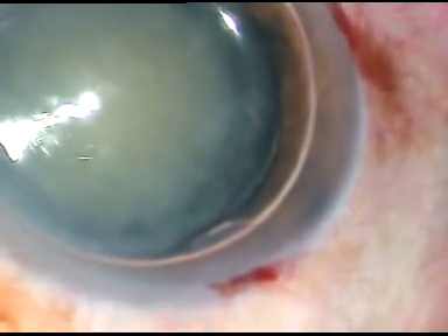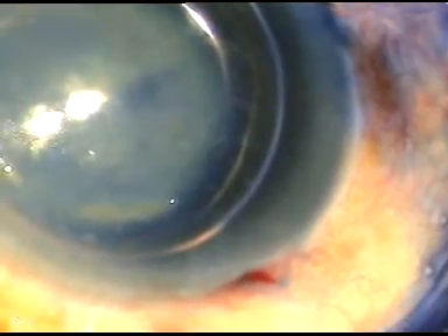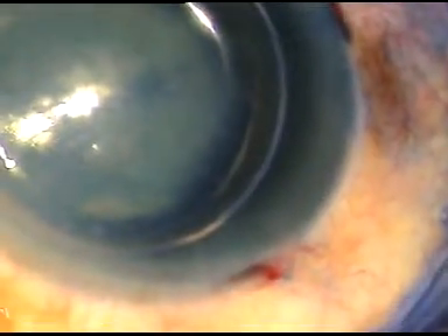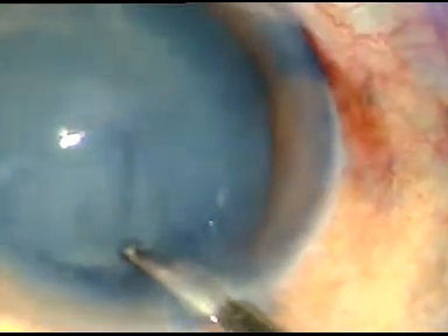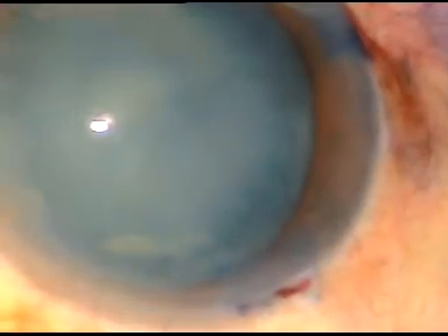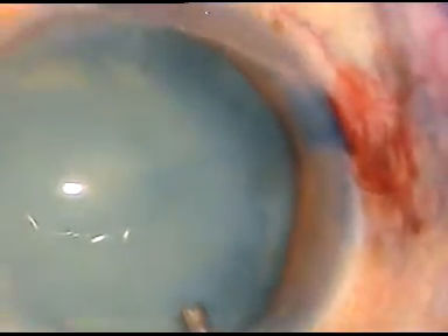An air bubble has been injected into the anterior chamber. Now this is trypan blue dye to stain the anterior capsule of this cataractous lens. The dye is now washed out. I use BSS to wash the dye out of the anterior chamber. Many colleagues don't wash it out — they just replace it with viscoelastic substance.